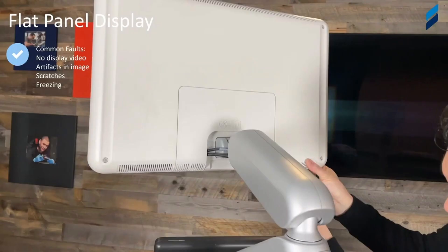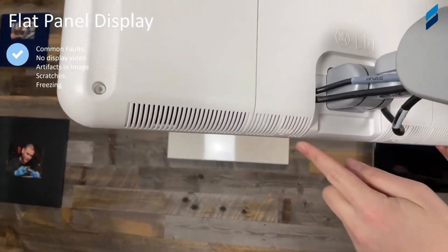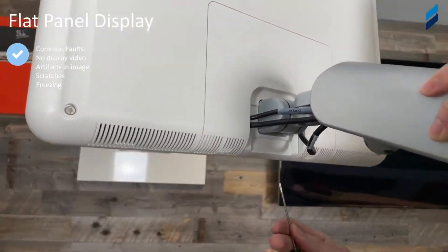This is disassembly to remove your flat panel display or monitor. Common faults include no display video, losing video during runtime, or any weird monitor-induced failures. It could be artifacts, scratches on the screen, or maybe some locking up at times — though locking up is more commonly associated with the e-box processing unit, but it does occur on the monitor as well.